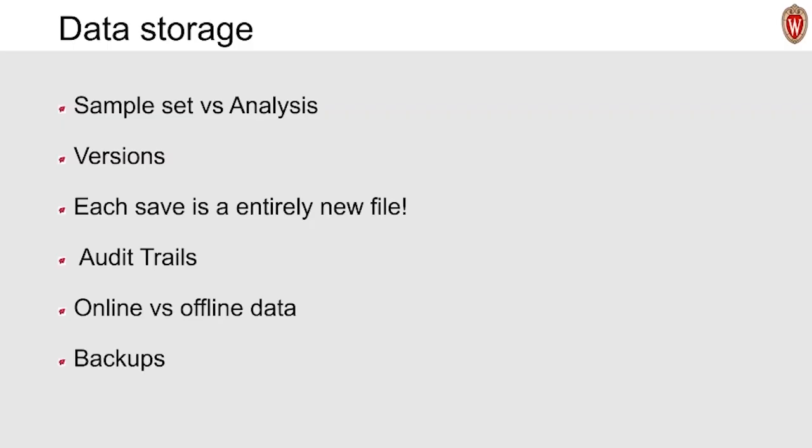Lastly, the Waters server has a scheduled backup job that it does nightly and weekly to fully back up everything that's online in the database. Our Oracle server that houses that online data is 12 terabytes in size, but we only use about 5 terabytes for around 1 year of online data. Backups of that 5 terabytes are just over 3 terabytes compressed. We use an 11 terabyte space carved out just for those server backups. And all of that doesn't include the RAID arrays that duplicate these disk drives in case of disk drive failure. So you can effectively double almost all of those storage needs.